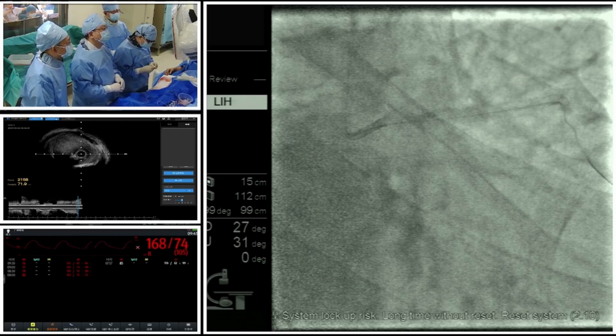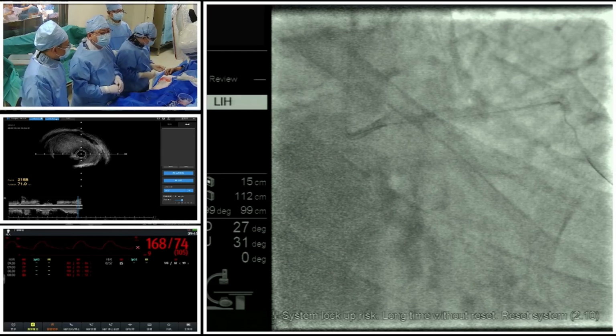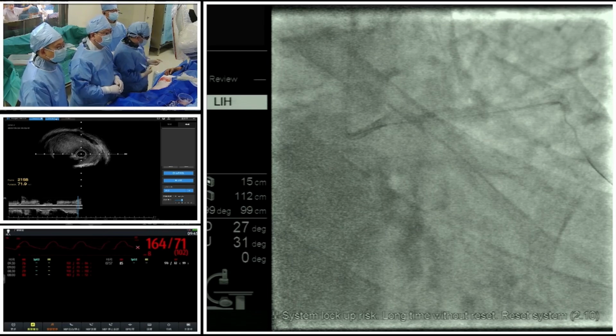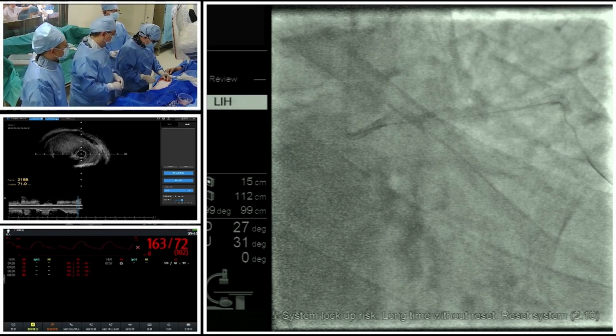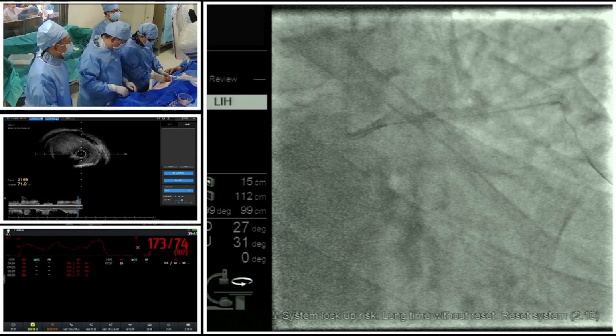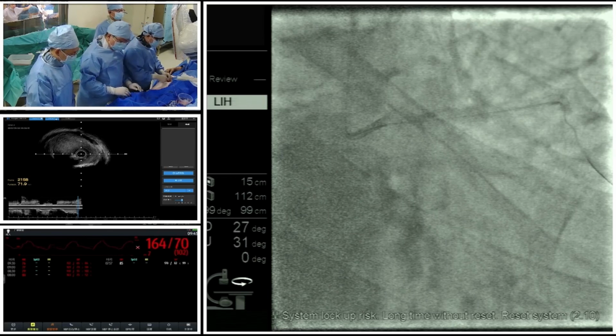And just like some articles tell us, if we choose the rotatripsy strategy, we can choose a smaller RA burr. In some statements, the experts told us the ratio of the RA burr to the artery should be 0.6 to 0.8.